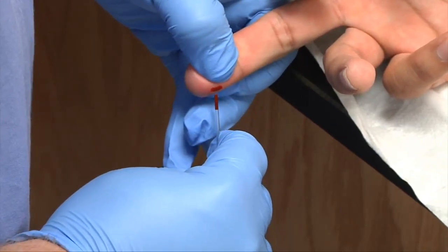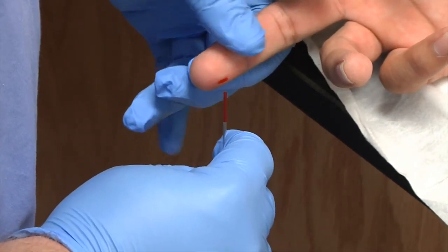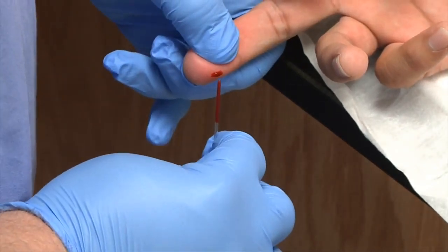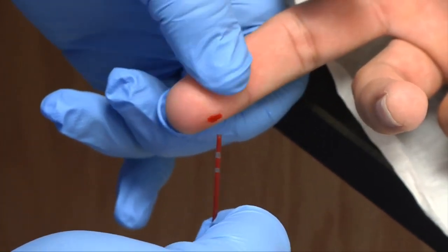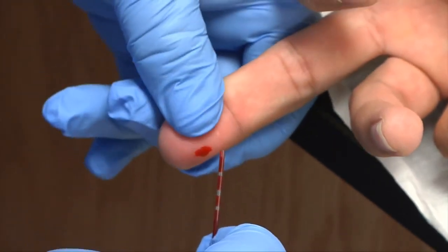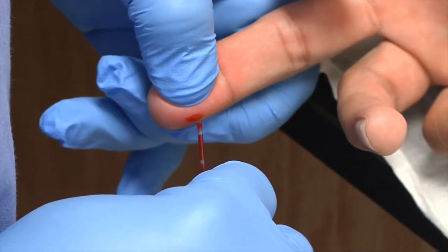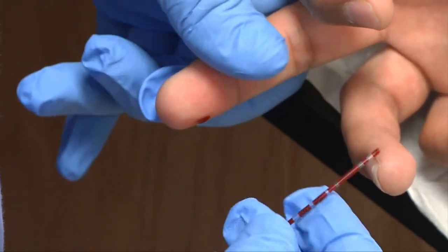You'll do this until your tube is full — allow yourself plenty of time. At this time it might be best to talk to your patient. It's a slow process. More likely we'll be performing these punctures for finger sticks on children past the age of toddlers up until adolescent years. If it was an infant, we would use the heel. Sometimes we'll do this on geriatric folks — they may be a little anemic or their veins cannot handle the vacutainer system. Capillary tubes are heparinized.